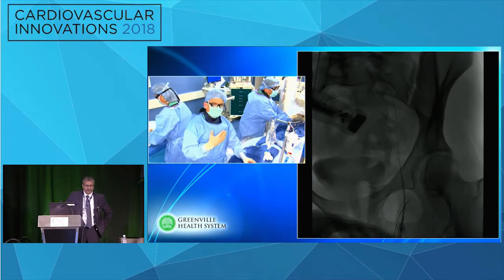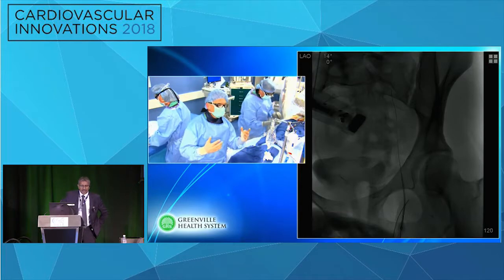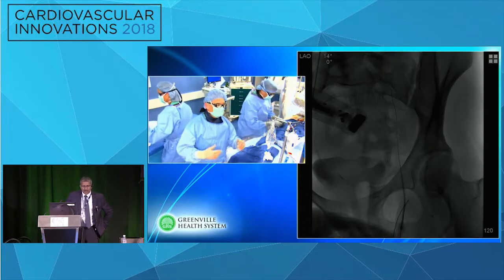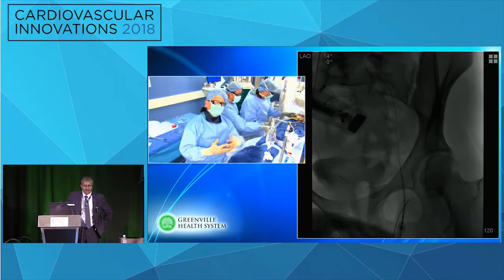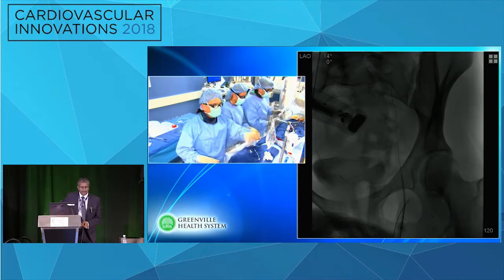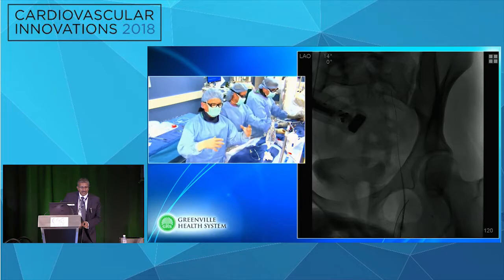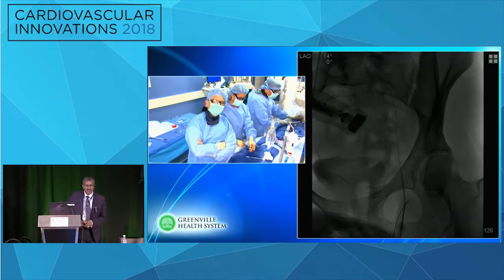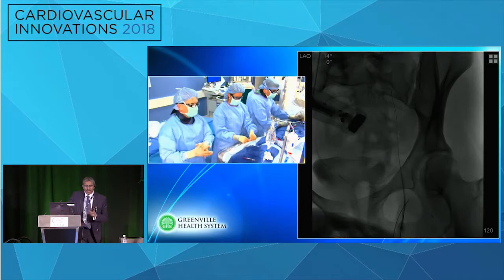Then, once we're able to get across, the plan is to angioplasty and then place a wall stent up to the level of the IVC. However, now that I see how much disease there is low, one of the challenges is going to be how low can we stent from an ipsilateral approach. So we may have to bring our wire up, snare it, and come around from our contralateral side to actually place a stent down lower into the common femoral vein, and then ipsilaterally we'll be able to place one up closer to the IVC. So you can talk through that. I'll help Dr. Devane here as we're working through this and go from there.